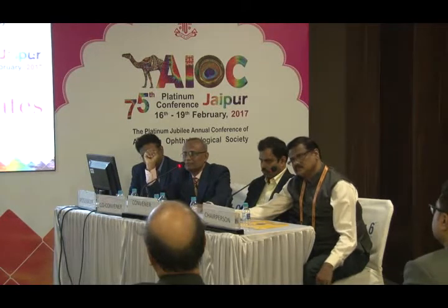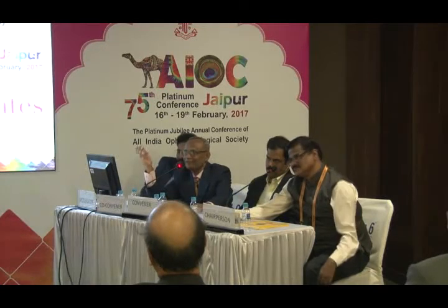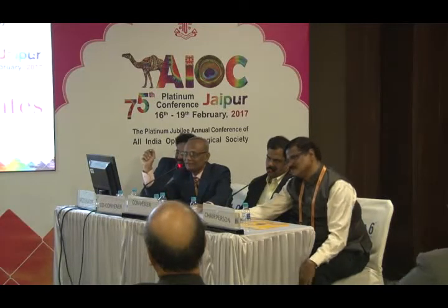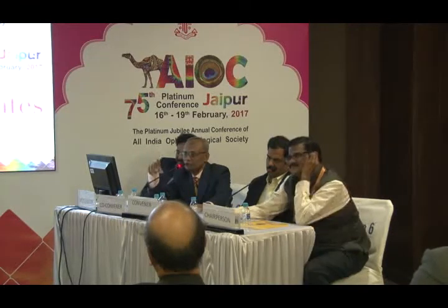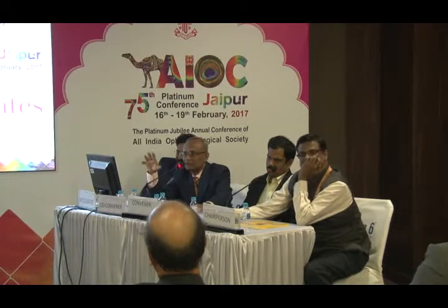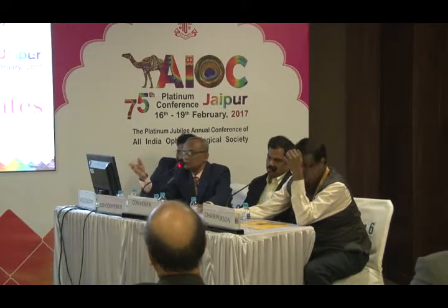It should be changed. I am using that only. So should I change it? No, that is not ideal. If you are not having any problem, maybe. I'm asking directly. No, it should be changed. A horizontal autoclave with a vacuum cycle. Not all horizontal autoclaves have a vacuum cycle. So you should have one horizontal autoclave. It will cost about 40,000 rupees more.